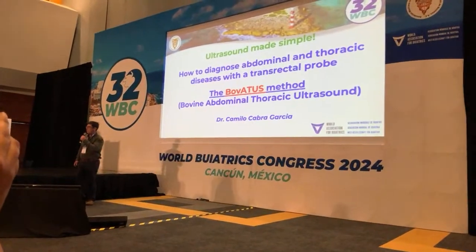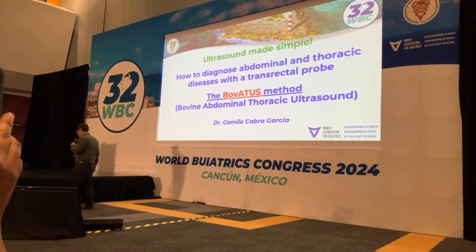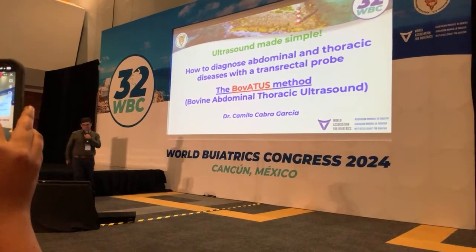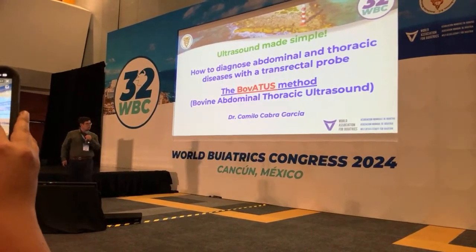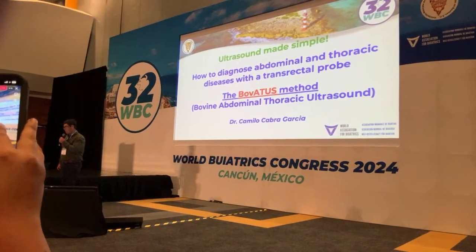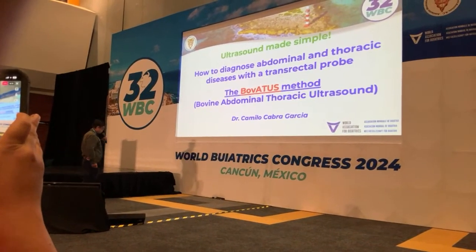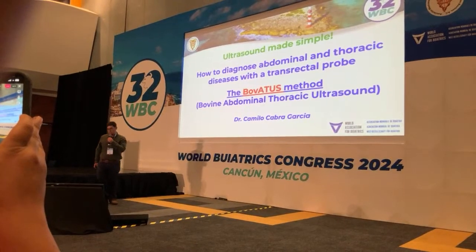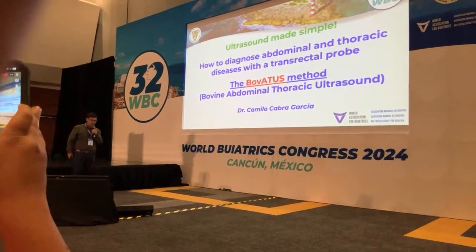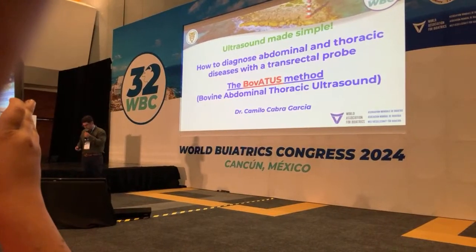Hi, everybody. I'm very happy to see a lot of people right here, and I hope this presentation will be very useful for you in the future when you are in front of a cow. It's an honor for me to present to you the summary of my professional life and how I have been using the transrectal linear probe to diagnose hidden diseases in cows. The name of this presentation is How to Diagnose Abdominal and Thoracic Diseases with a Transrectal Probe, the BovATUS method.